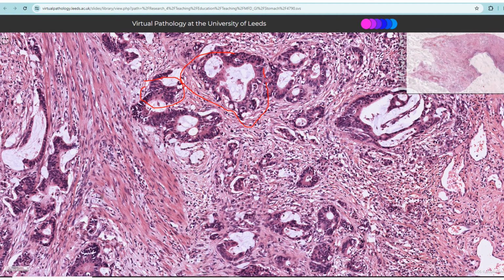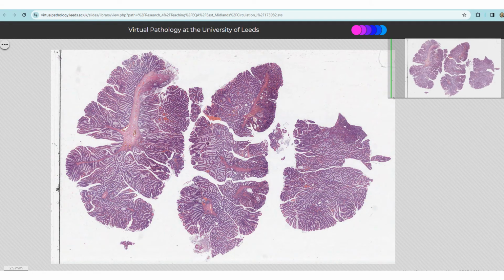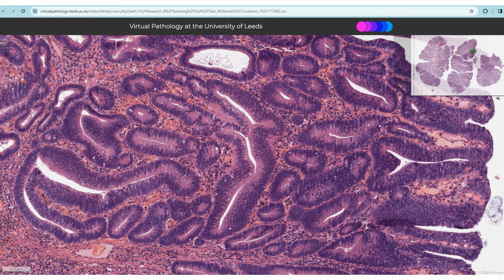Okay. Next is tubular adenoma. This is a polyp, a neoplastic polyp. You can see it has a polypoidal architecture, and there's a stalk there. Most importantly, it is composed of proliferation of glands, and these glands are dysplastic. You can see features of hyperchromatic nuclei and pleomorphism there and there. It's not yet invasive, but it is dysplastic.